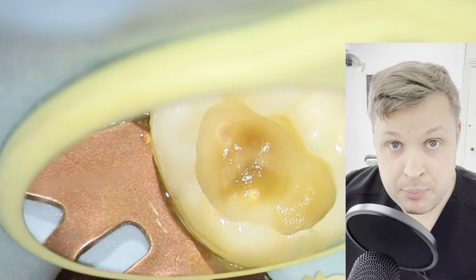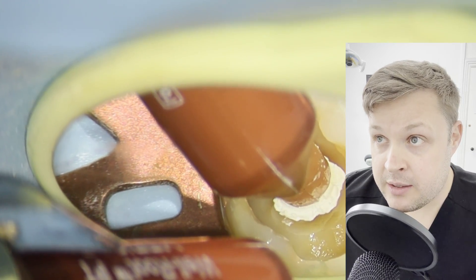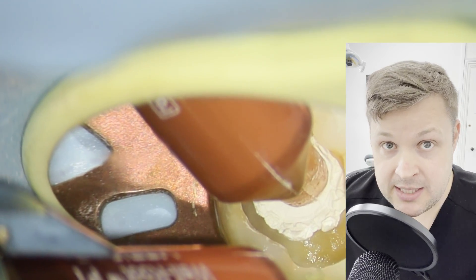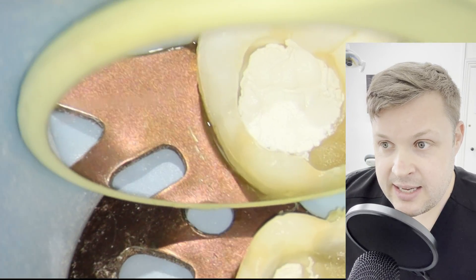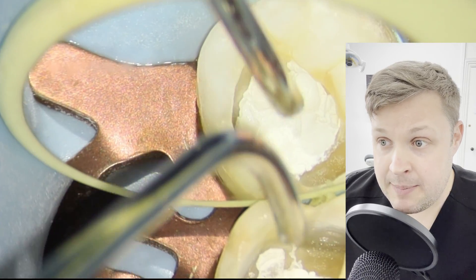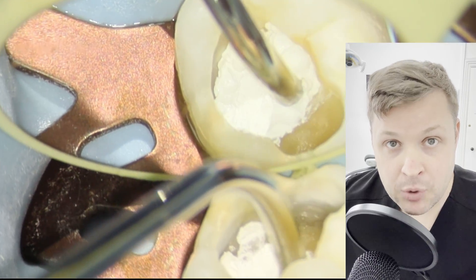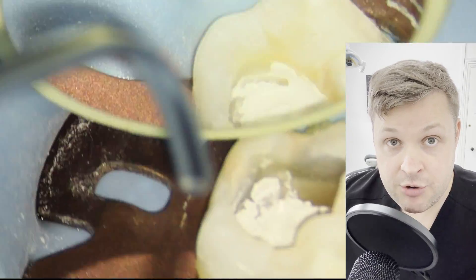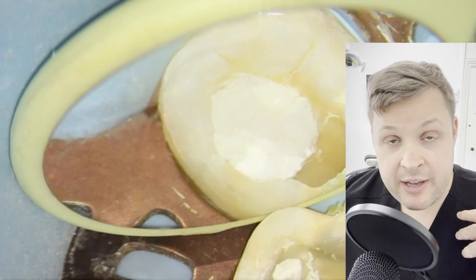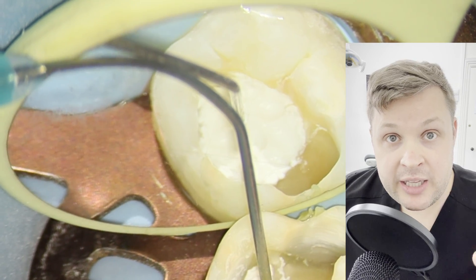Now I'm going to use a bioceramic putty called Well Root — it's absolutely fantastic. The properties and ability to manipulate it are really nice. A tip: when applying it into a cavity, make sure the cavity is moist and not completely dry, because if you apply it to a completely dry cavity it will lift off. Also remember that bioceramic sets in the presence of moisture, so it doesn't matter if it's wet in there.